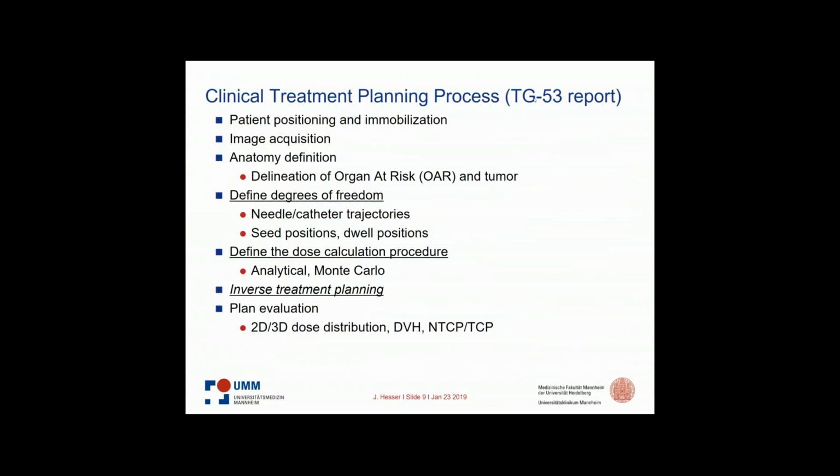So this report is about the general treatment planning process. If you read it carefully, it's more for teletherapy, but the steps, which you see here on the slide, are mostly the same as for brachytherapy. When you do planning, you have to do the imaging, then the anatomy, and patient positioning depends. When you have an HDR case, you first have a CT, let's say, and insert the catheters.